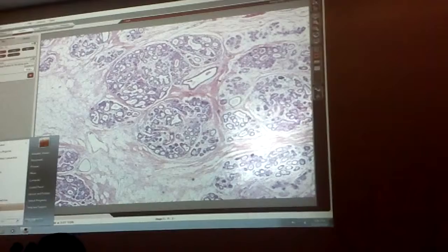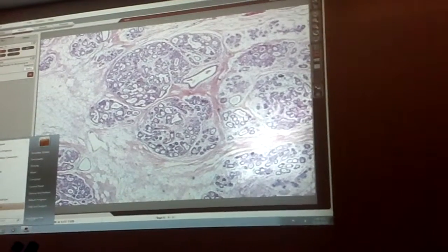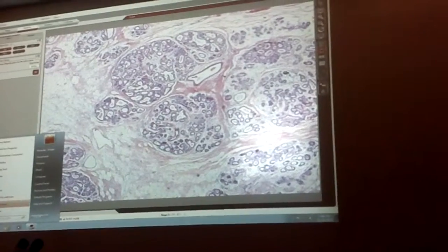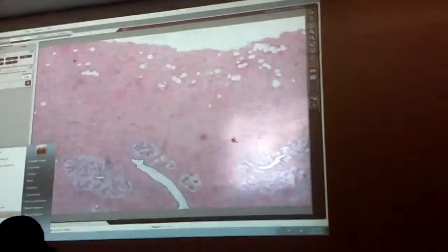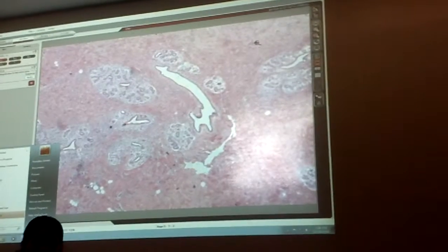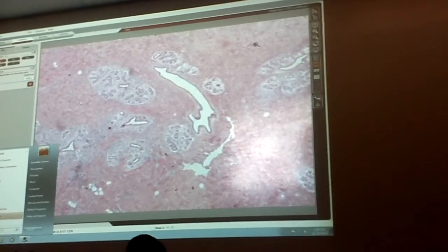And what's also going to help you figure out if it's the resting or lactating is that inside the glandular alveoli, again, you should see something inside those. In terms of the milk in there. So can you tell the difference between the two?